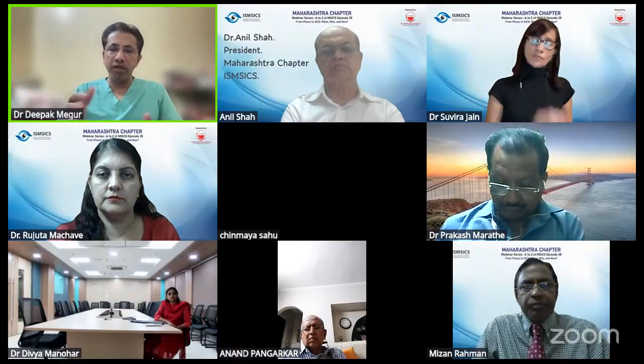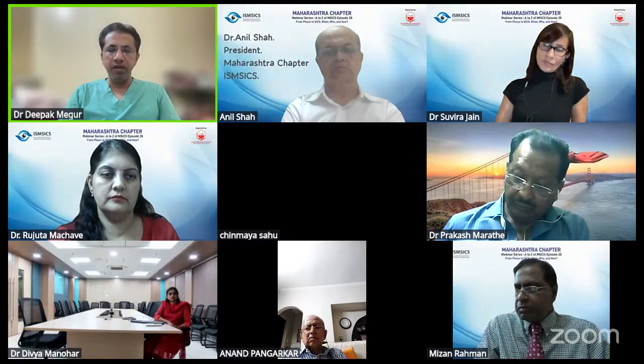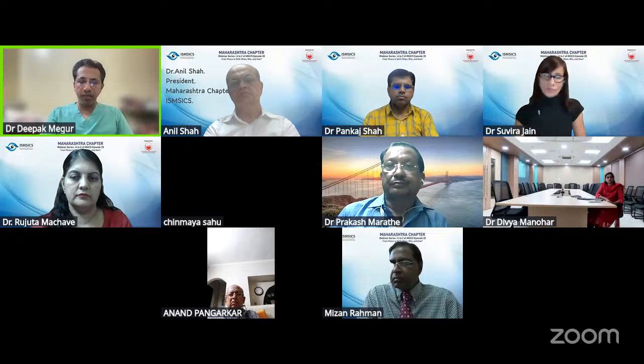So the first choice always is going to be perform a scleral tunnel either in the same quadrant or 90 degrees to be away from it. But in the worst case scenarios, we don't have enough time. That's the only situation where we would like to enlarge the clear cornea. I think with that, I'd like to conclude. Thank you for the opportunity.